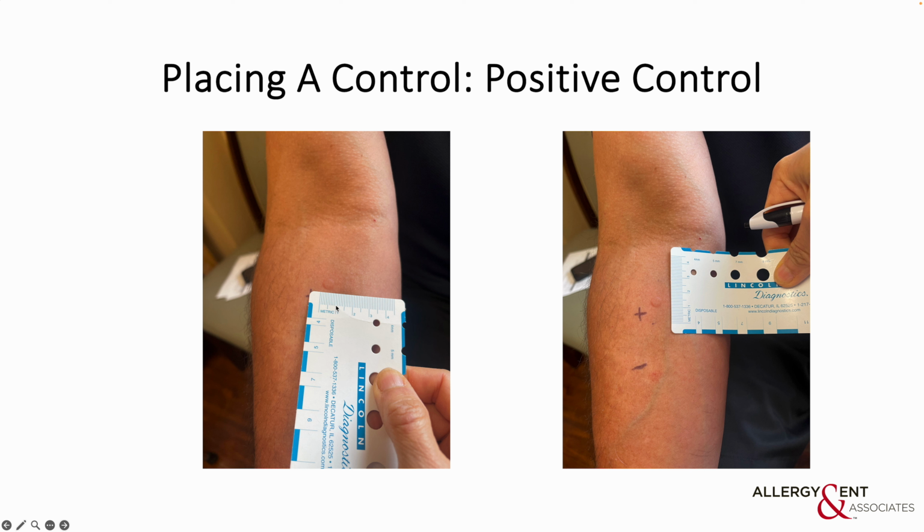You have 10 millimeters in 1 centimeter. So from here to halfway is 5 millimeter, 10 millimeter, 15, 20. When we measure the skin test, we read in millimeter, not centimeter, from the small lines right here.